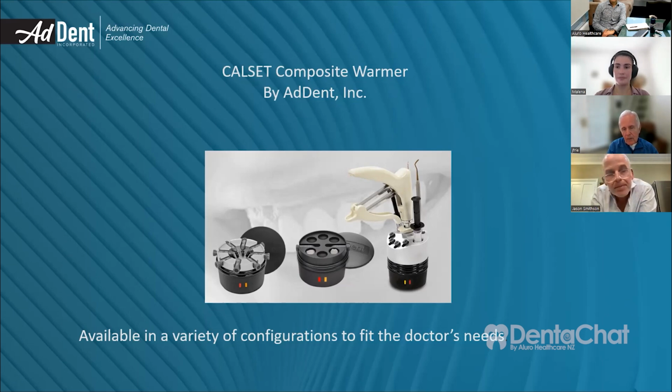But the other aspect of safety is something that we should keep in mind. When we polymerize these composites, the exothermic temperature of the polymerization reaction is so much higher, and there have been studies to show that. And if you want to go higher than that, you can look at one or two studies on the actual use of a high-speed drill and what happens to the temperature there.